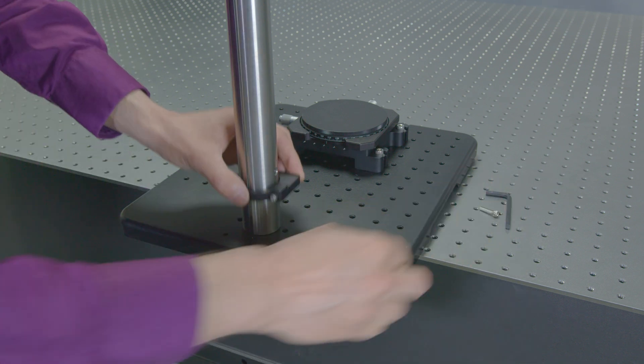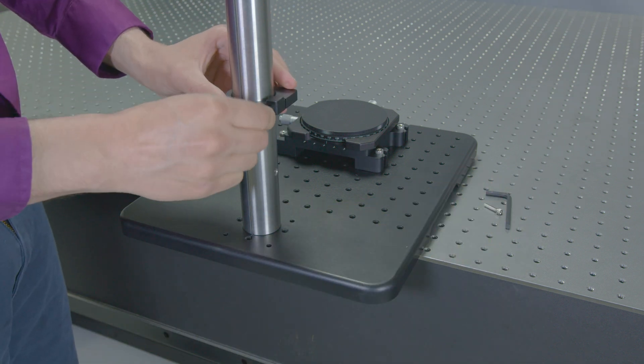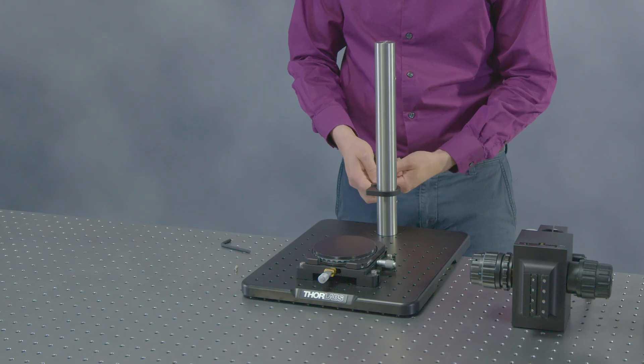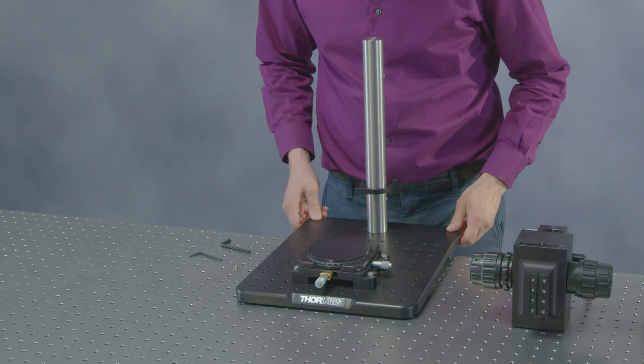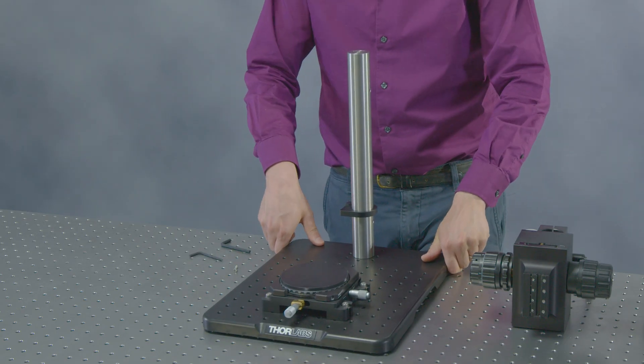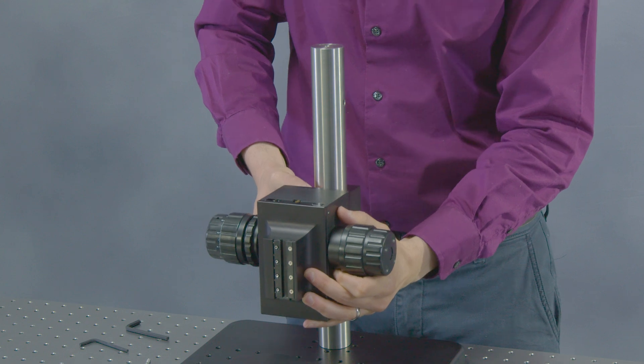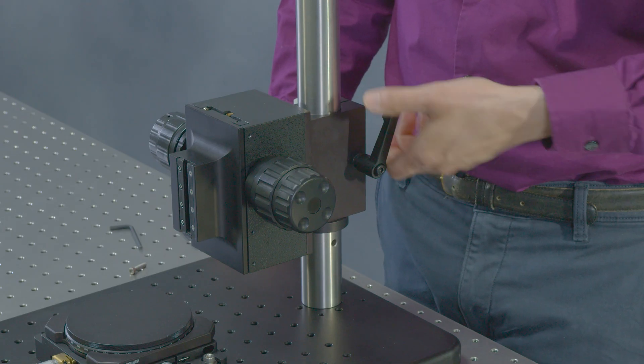Next, loosen the safety ring to slide it several inches above the base. Use the hex key to secure the ring in place. Place the focus block onto the post and use the lever to tighten it into place.